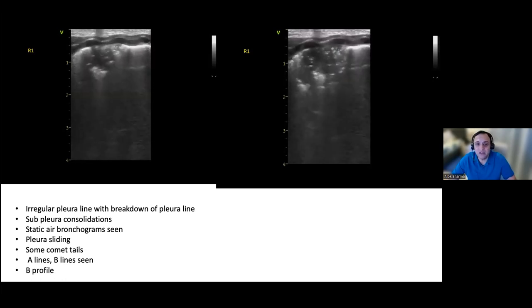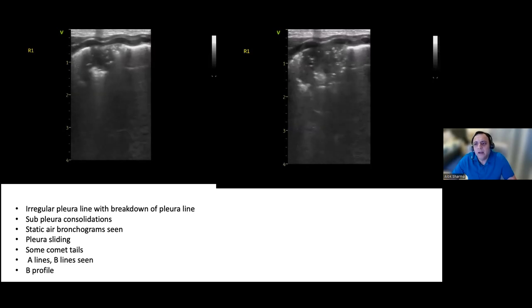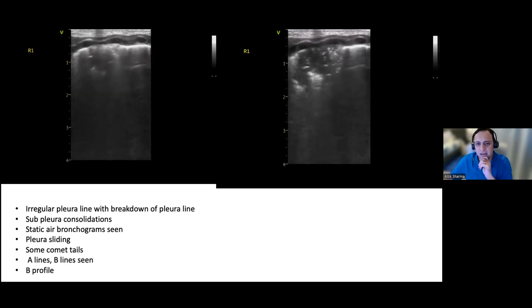It's a beautiful image. I just love the way you've got your anatomy up to the four. And again, it's just an example of the benefits of sometimes using a lower frequency to get that depth. And there's no harm, Doris, in just putting your frequency up, just because you're using a low frequency. You're using a GE, right? Yes.